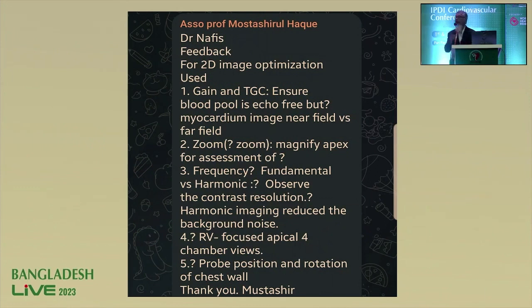So after producing all these videos, our faculty also gave some feedback. Our faculty said, why did you increase the zoom to visualize the apex? You could increase the depth, or you could decrease the depth, so you could visualize that better. And there was other feedback that really helped them to learn.